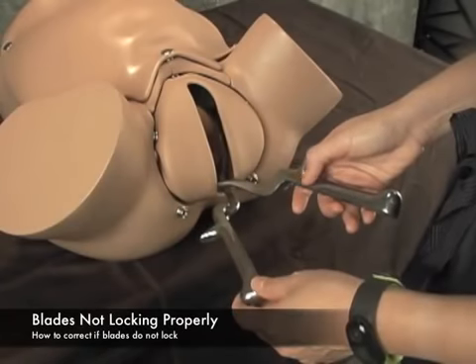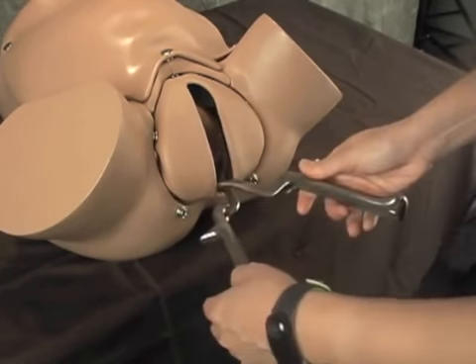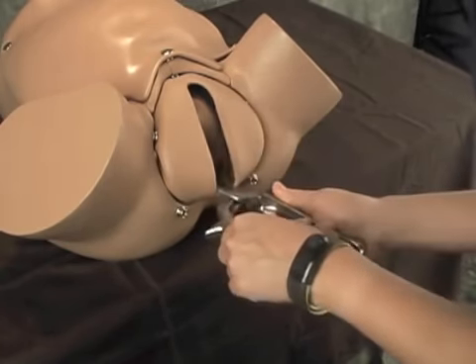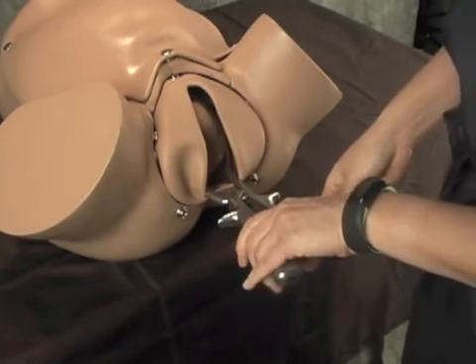If the blades don't lock properly or diverge widely, readjust application by lowering the handle while slightly elevating the heel of the anterior blade. If the handles fail to lock, remove the forceps and repeat application.